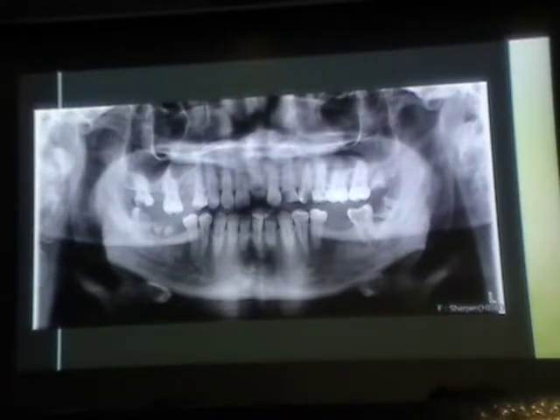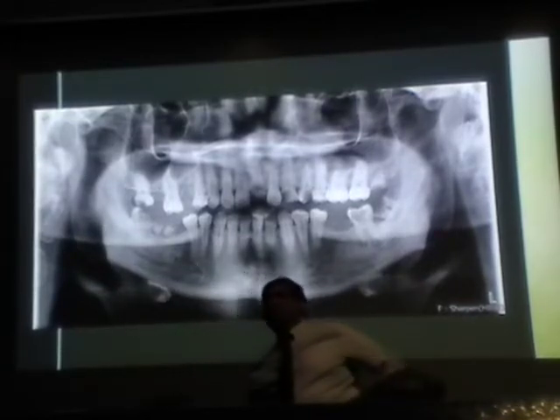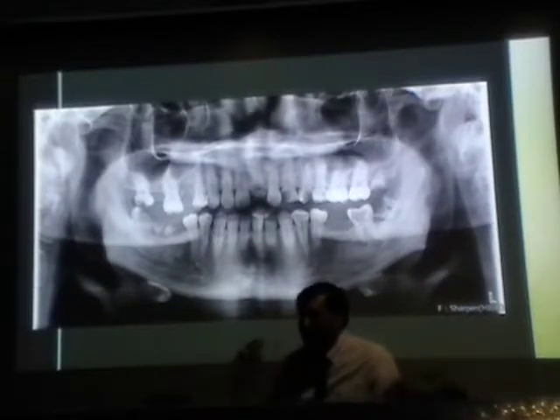For intraoral images, not really. So that's the distinction. To clarify, before reiterating again, for kids we use the apron and the collar. Why? Because thyroid is susceptible to cancer, they have high sensitivity, but when it comes to pans, no one uses collar.